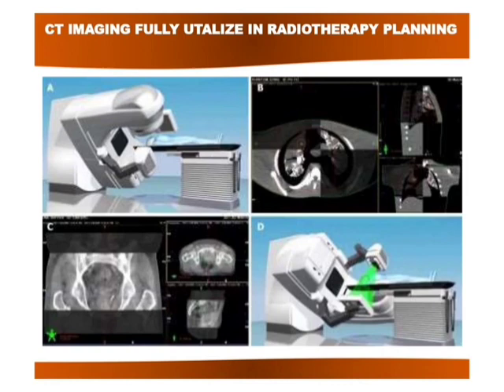So CT imaging is fully utilized in radiotherapy planning, and you see in the case of fusion techniques, the CT is the base. You must have heard about CT-MRI fusion and PET-CT fusion, but you have never heard of MRI-PET fusion.